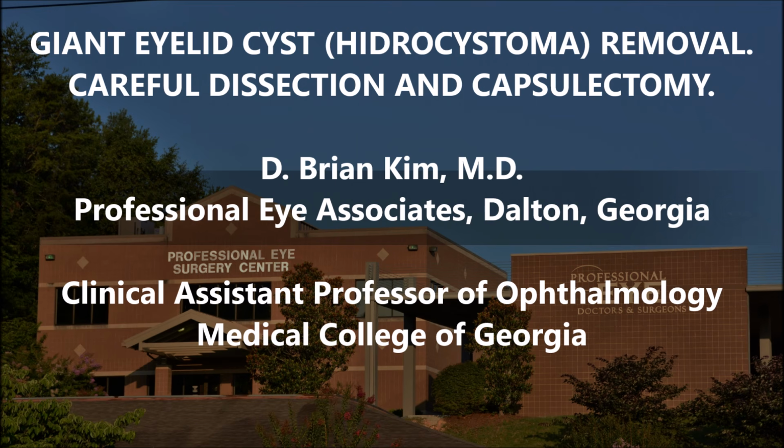This is not my typical case. I normally show intraocular surgery, but this was such a giant cyst, one of the biggest ones I've ever seen, so I wanted to just demonstrate the removal of the cyst and try to remove the entire capsule in doing so.